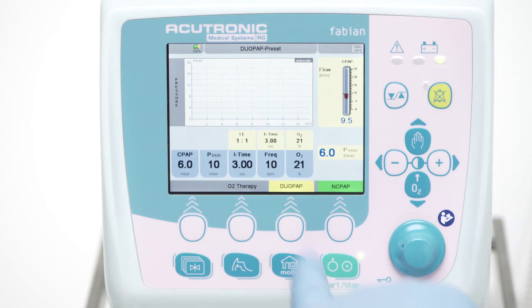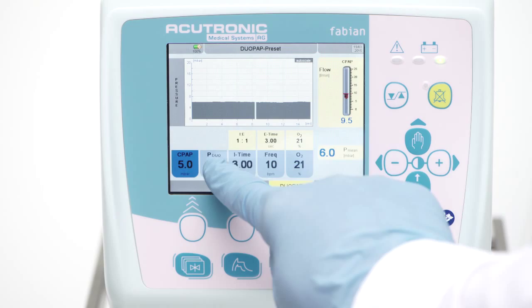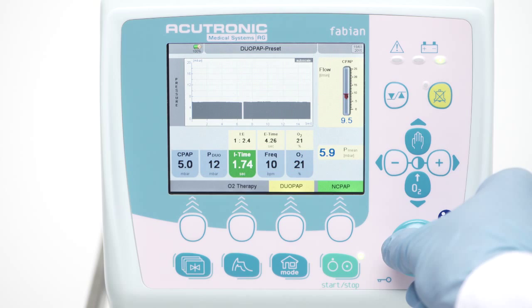In DUO-PAP, the following parameters need to be set: the CPAP level, the upper pressure level PDUO, the inspiratory time — better described as transition time from the lower to the upper CPAP pressure level — the frequency of bi-level transitions per minute, and the O2 as required.